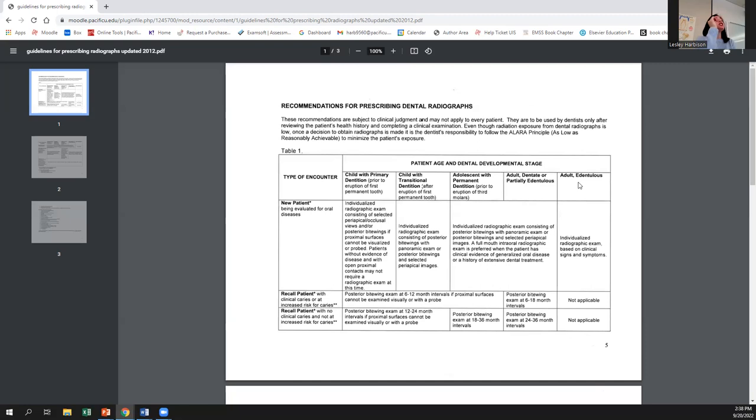have any teeth. And yes, you still take x-rays on somebody who doesn't have teeth because you want to evaluate their jaw, their joint, you know, changes in that whole area. You can even see calcification of the carotid vein, artery. I need to go back to anatomy and physiology, but you can see calcium buildup in the carotid artery if an older person has that going on. So there are lots of reasons to still take an x-ray if someone doesn't have any teeth, which can be surprising. But then you would look down here.